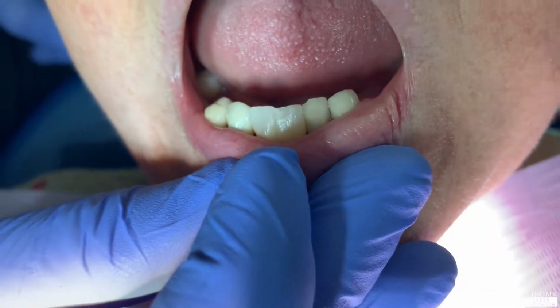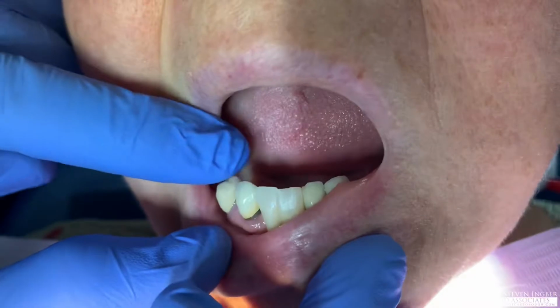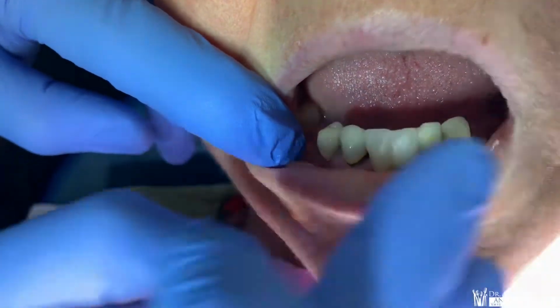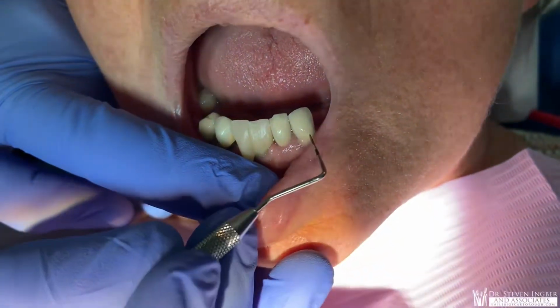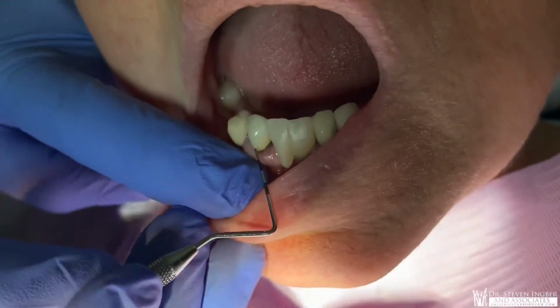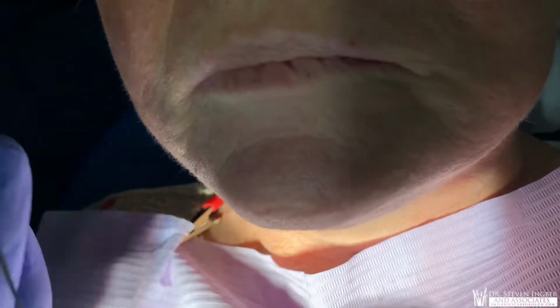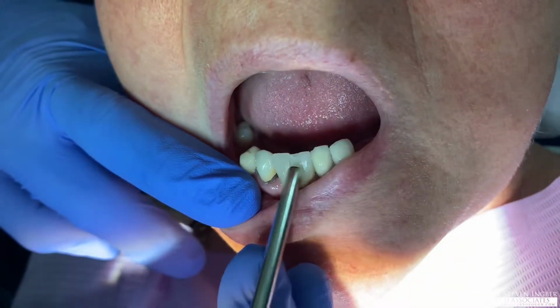And boy, this was a really tough job to get her bite to wear in. She doesn't wear a lower denture. She hates dentures, so she's really worn on this area. And I inherited previous dentistry that's decades old here, and here. And I said to her from the beginning, I never want to treat these teeth, for a lot of reasons, but that's beside the point. But we had to treat one tooth that finally failed, which is in here.